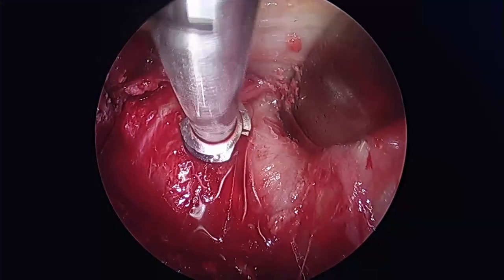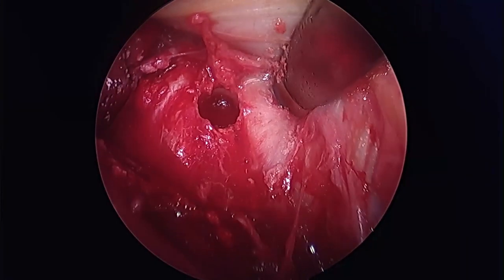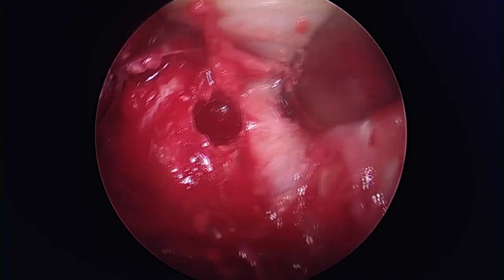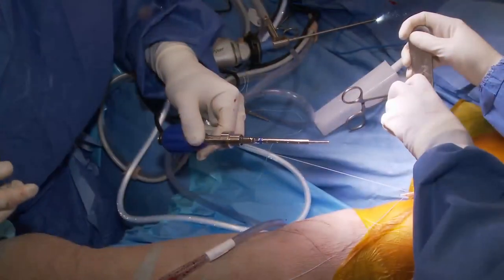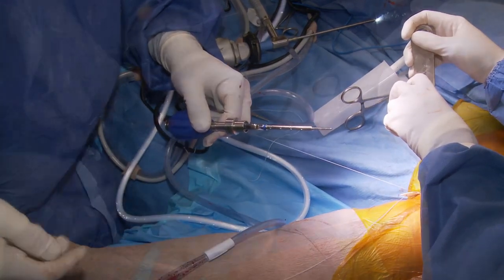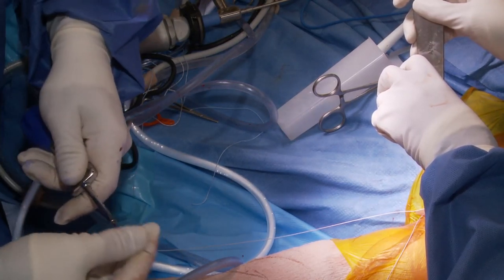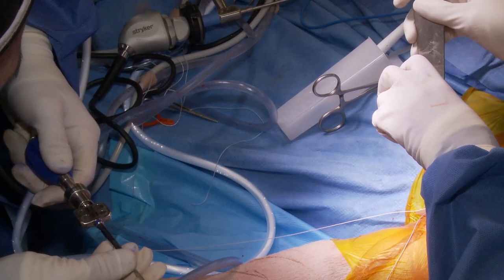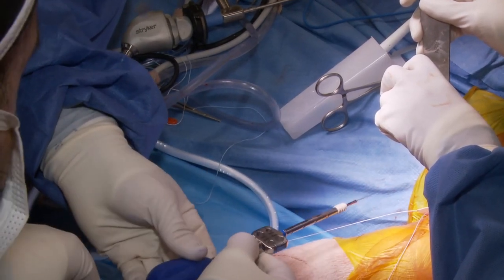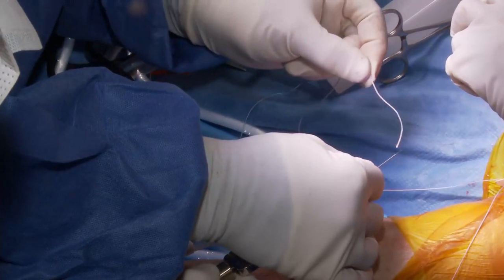Chris, I'm going to need your help. Now we're ready to insert the biceps into place, so I'm going to need you to try to hold on to the, let's load this first. Okay, so let's go to the sharp end. Yeah, so hang on to this end. Thank you. Okay, so we have the screw and the wire. Hold this right here, hold it up close to the surgical site. Yep. And we'll pass this through the loop.